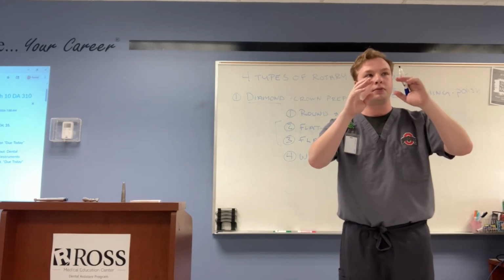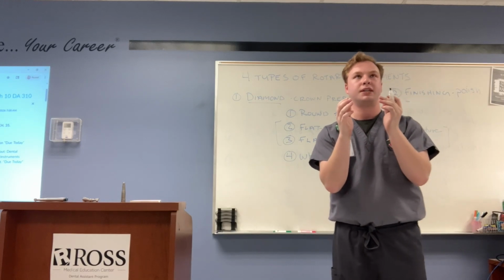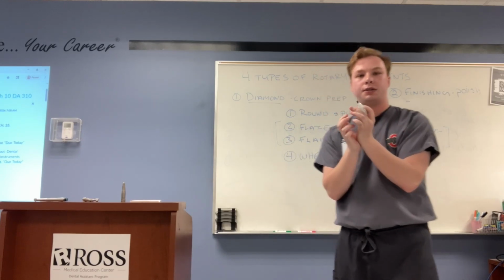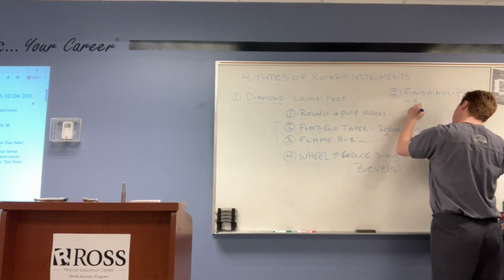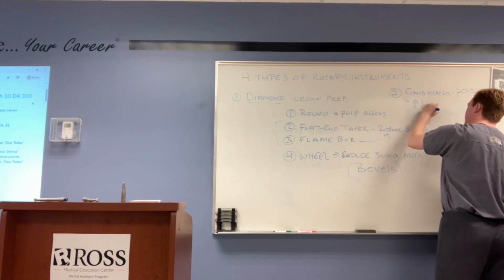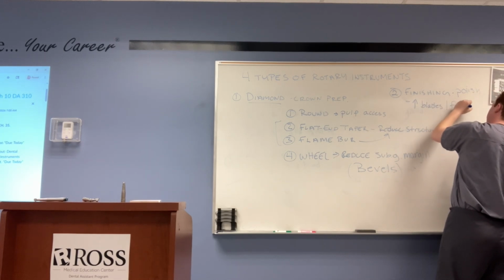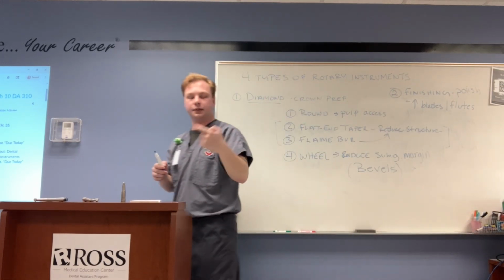So you have, how do I want to say this? The surface area of blades are increased on this. So I'm going to write a big arrow, increased blades or flutes. Those sharp edges at the end.